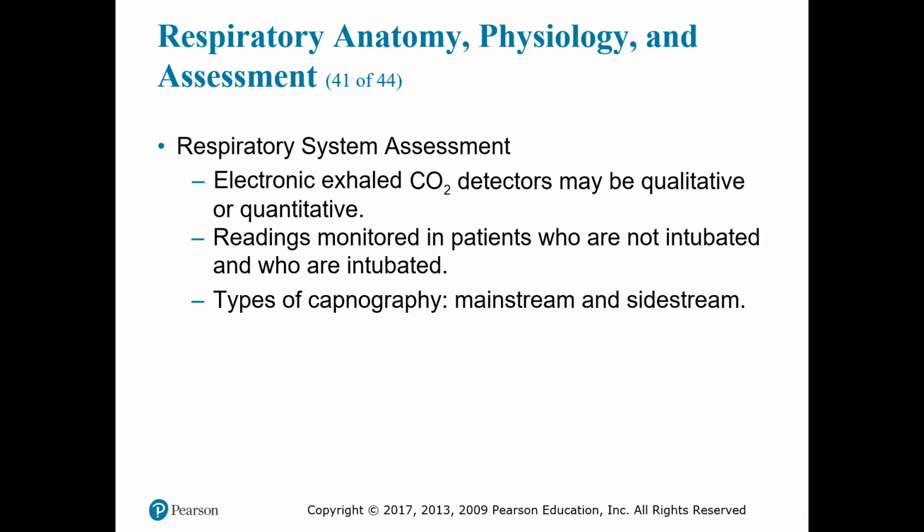The modern capnometers can display a number, and they're also going to give a digital waveform, like an EKG gives us a visual representation of the heart. This is going to give us a digital representation of the entire respiratory cycle, from inhalation to exhalation for every breath. There are two major types of capnography: mainstream and side stream.